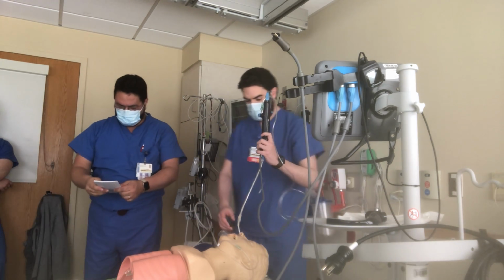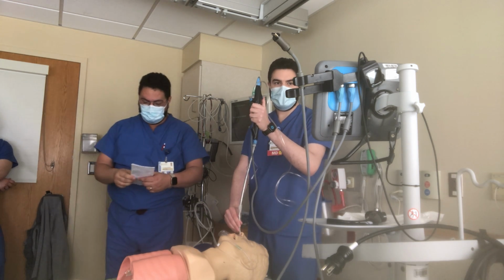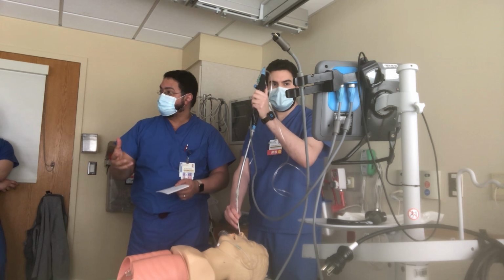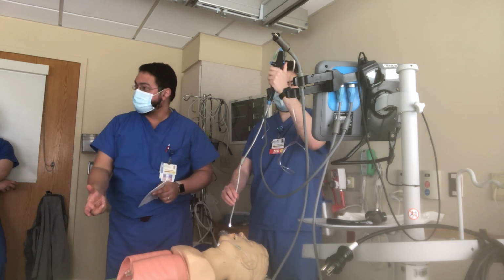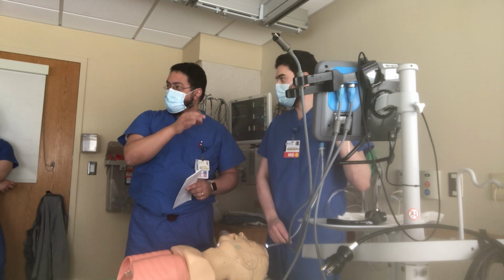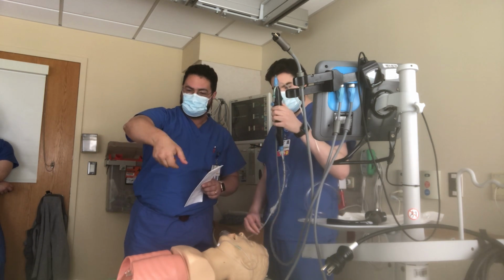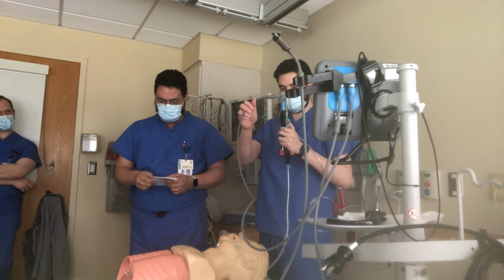That's the fiber optic intubation, right? Yes. We forgot to say call the team, by the way. You have to call the team. As soon as the tube is in, propofol is hanging, right? For all of the medications that we give, we always forget that the propofol has to be hanging on the patient's IV once the tube is in. Then you wheel the tube over. If the tube gets hung on something, what do you do? You turn it 90 degrees until it passes, right? Once it passes, then the nurse will inject the propofol, okay?